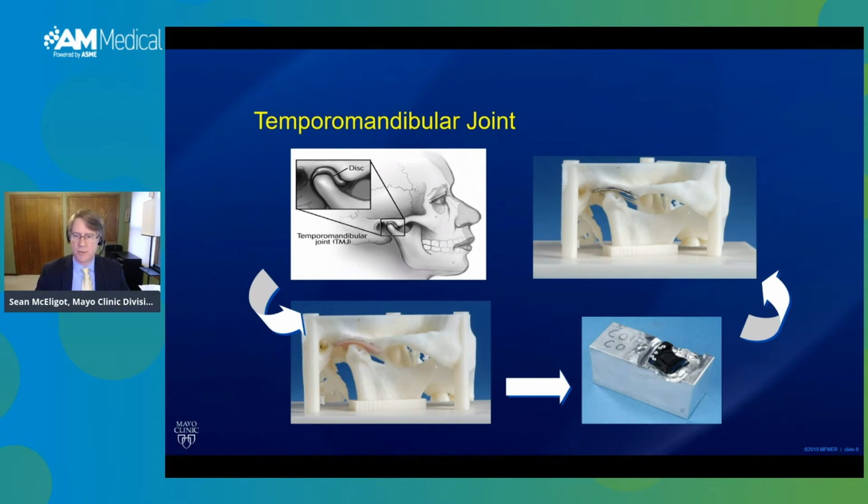We laser scanned the wax model and then machined the implant out of cobalt chrome molybdenum steel. Here you can see the implant back in the model as it will be in the patient. The work extended from 2006 to 2009, and we machined over 100 patient-specific implants.